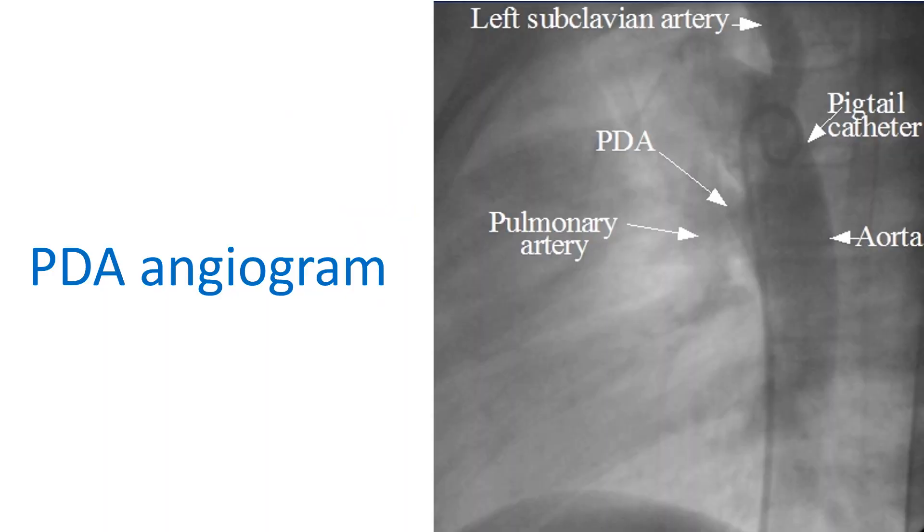Initially, an angiogram is taken to confirm the size of the PDA to choose the size of the device. This angiogram shows a pigtail catheter in the descending aorta and the contrast passing from the descending aorta to the pulmonary artery through the PDA. The PDA is superimposed on the tracheal air column in this view.